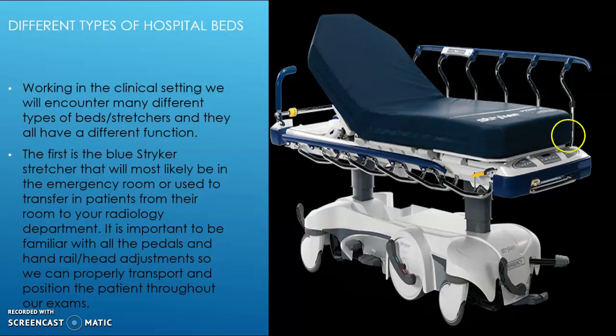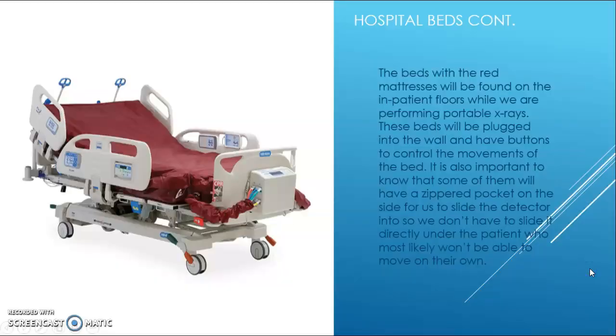The pedals I use most often down in the ER, especially when sliding patients. We'll pump the bed up, and then drop either the head or the feet down by themselves, and then slide them easier. It helps.